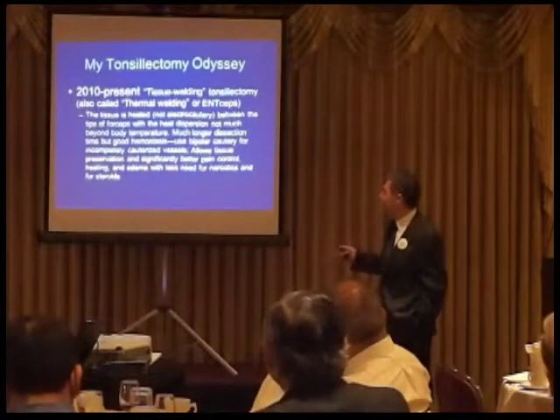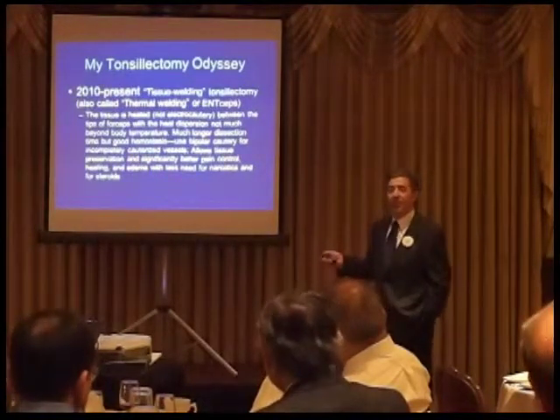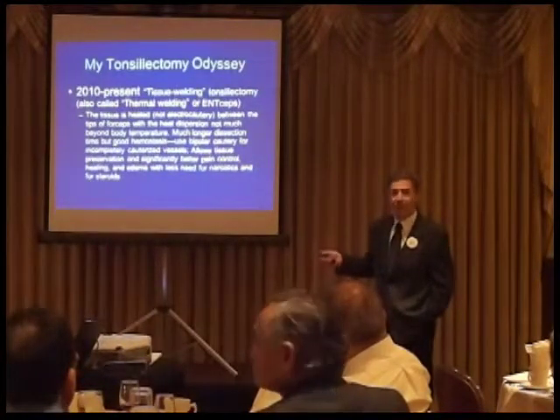And I think it does have significantly better pain control. I remember my nurses, remember these are all adults practically that I do, saying, wow, we're not getting the phone calls. We have to call them up to see how they are doing. They're just doing fine.